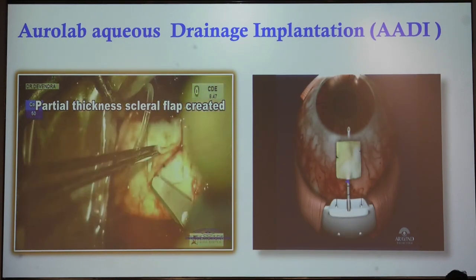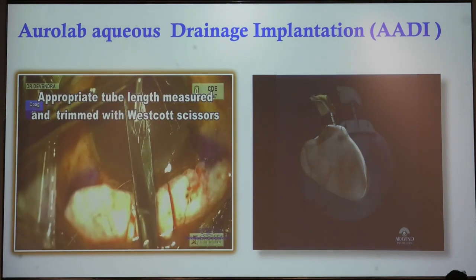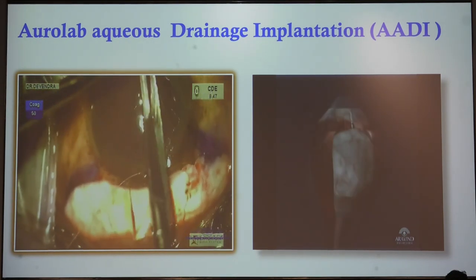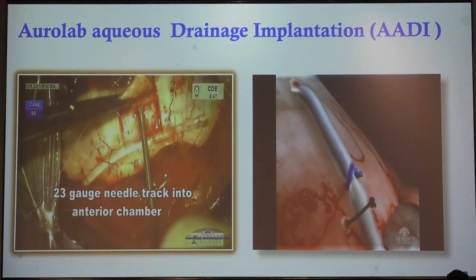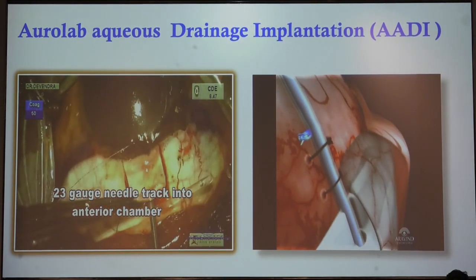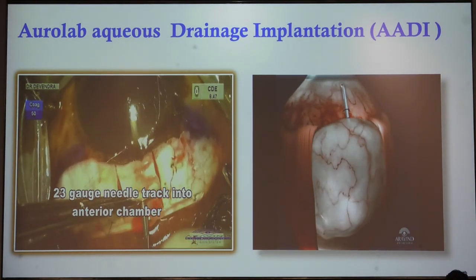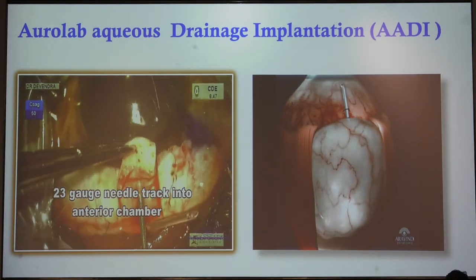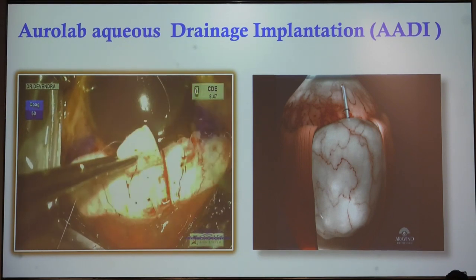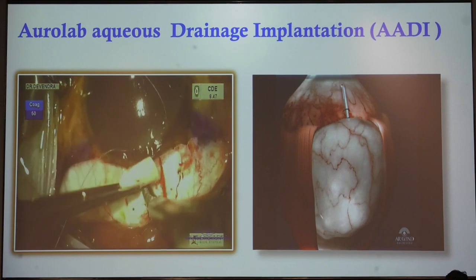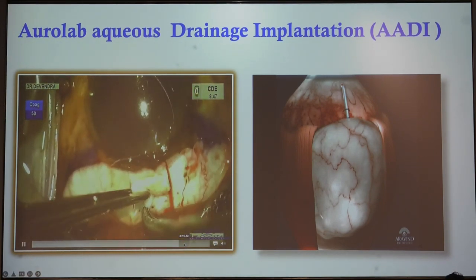During the COVID period we really struggled because patch grafts were not available. So we can make a tunnel instead. The appropriate length of the tube is cut — around 2.0 millimeters — and a 23-gauge needle is used to create the track. It is important to be careful because this is a partial thickness pass. The needle goes in, and with the same movement you come back and push the tube into the anterior chamber. The flap is then closed using two Vicryl sutures.